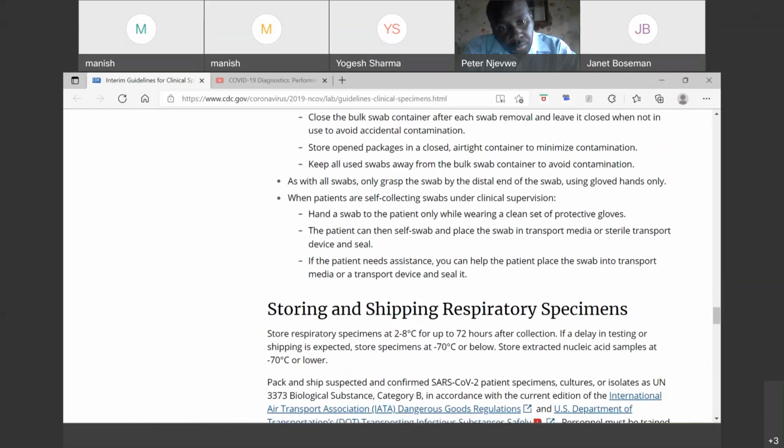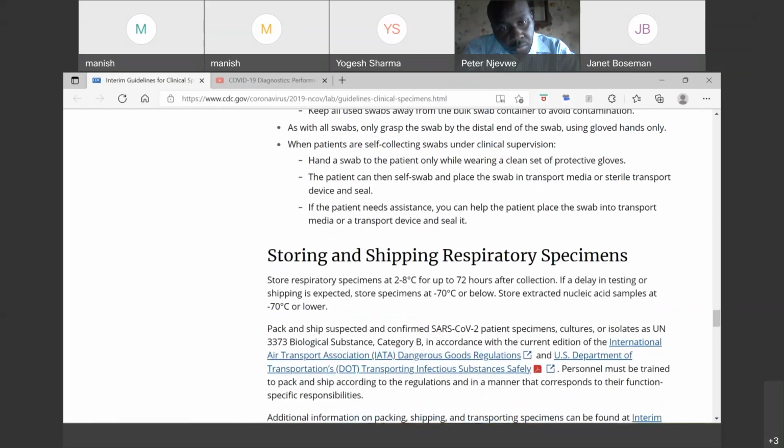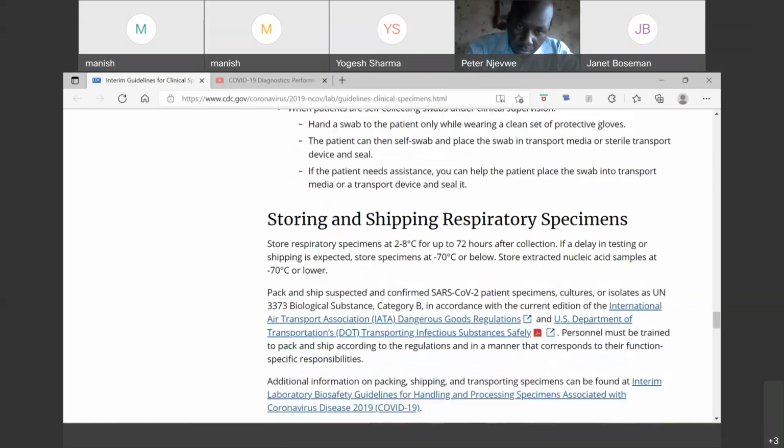When patients are self-collecting the swab under clinical supervision, hand the swab to the patient only while wearing a clean set of protective gloves. The patient can then self-swab and place the swab in transport media or a sterile transport device, and it should be sealed. If the patient needs assistance, you can help the patient place the swab into the transport media or transport device and seal it. If they are not able to do that, we have to help them.